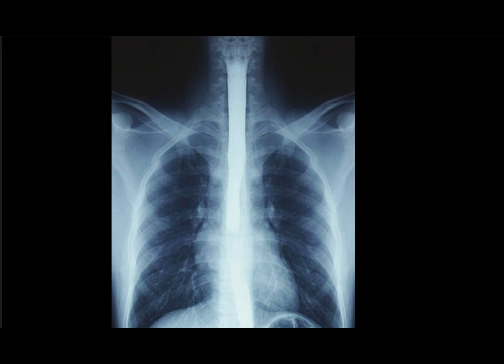And remember from the previous video, I told you that the patient will drink the contrast. So the contrast will initially pass through the esophagus before it gets to the stomach. So you cannot have a barium meal without the esophagus being visible because the contrast equally passed through the esophagus. So the key way to differentiate both of them is what you're trying to visualize.